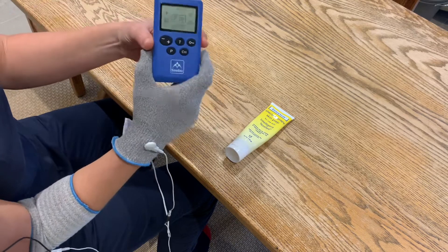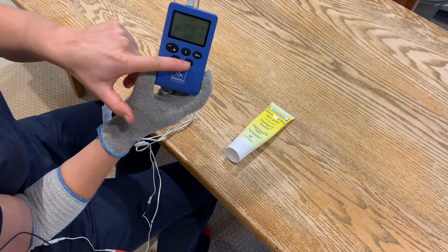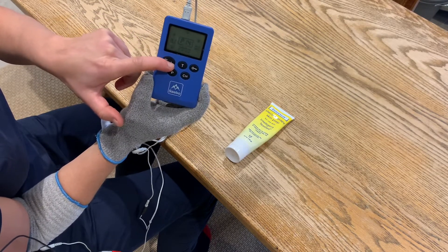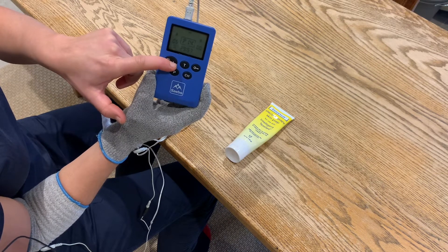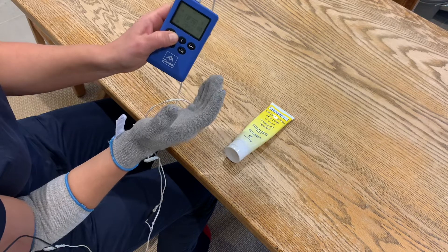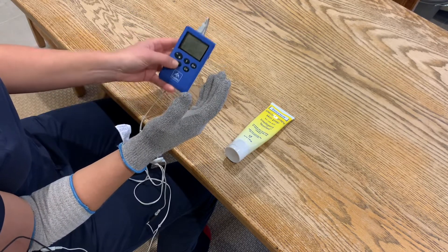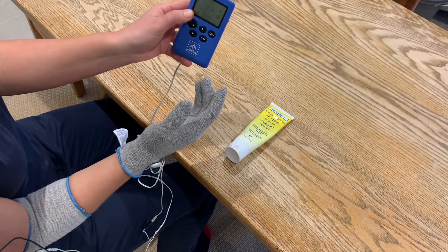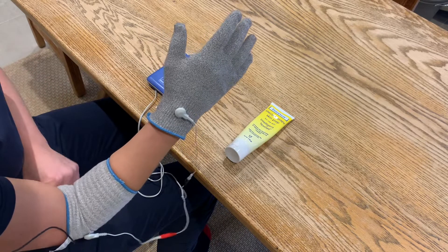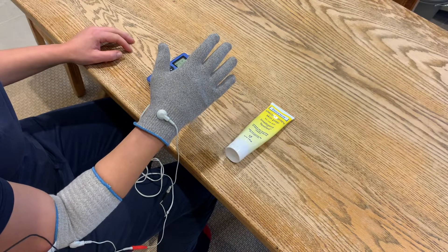With the device, make channel A flash by pressing CH again. Then turn up the stimulation until the point you just feel a tingling in your hand. When you first feel that tingling, switch it down one notch. Therapeutically, you want the stimulation to run just under the level where you would feel it.